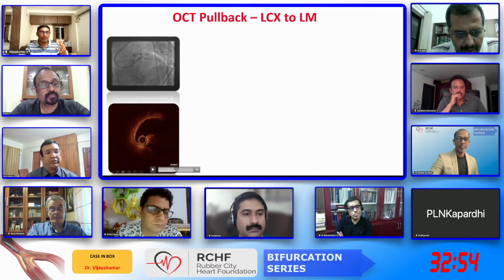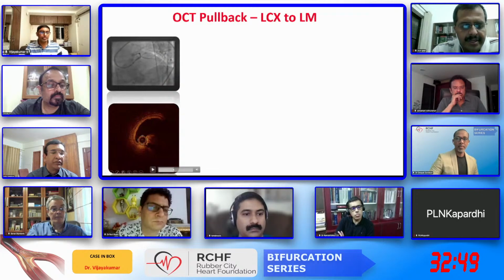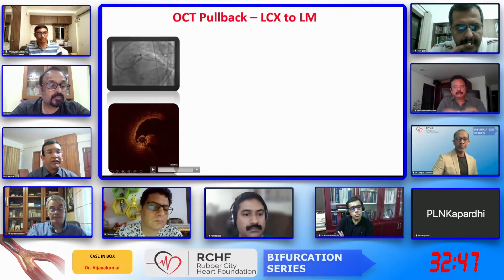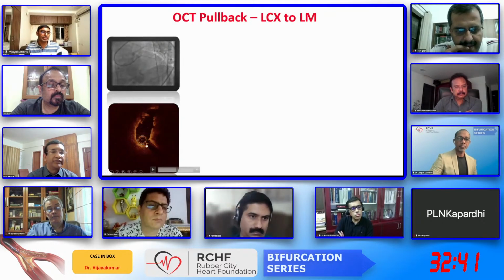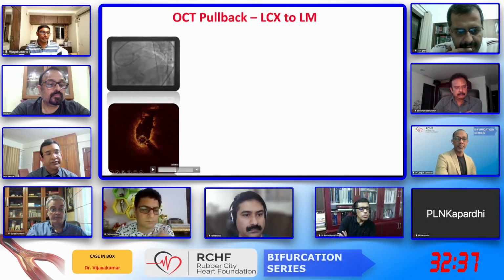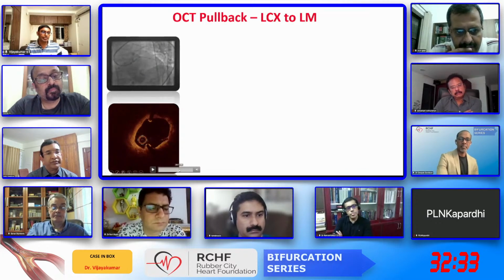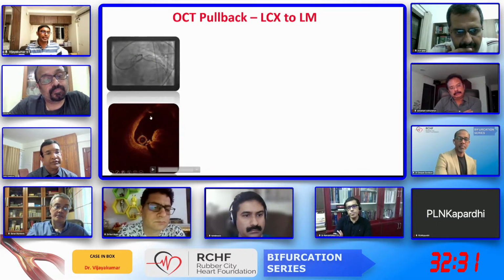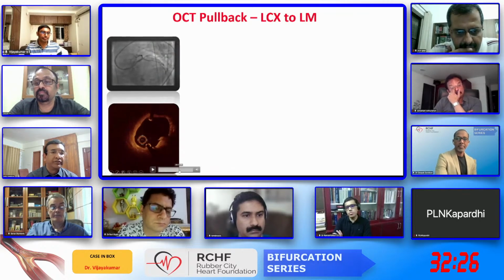Till this part, do you want to make any comments here? This is a calcified nodule protruding. And this is the ostial LCX. You can see the cuts here. This area is cut, but still the big calcium nodule is sitting here, and it was extending into the distal part of the left main. You can see that the LAD wire is coming here, and this is your distal part of the left main.